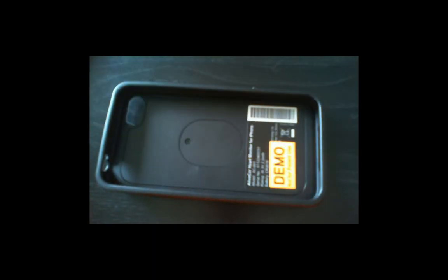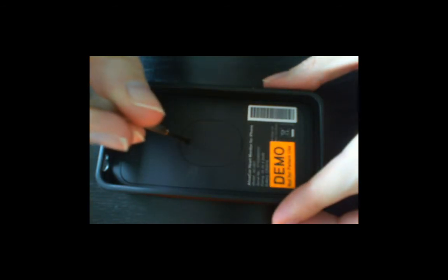Put your thumb in the camera hole cutout and gently push while pulling back on the top left corner of the case. Avoid taking the case off using any other methods. Then, using a small Phillips head screwdriver, remove the battery compartment door.